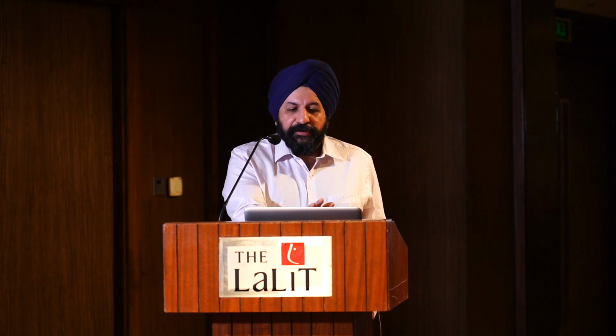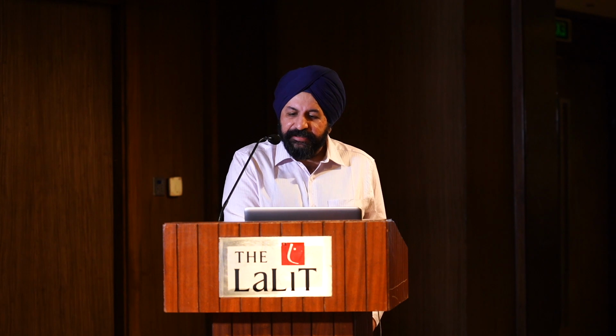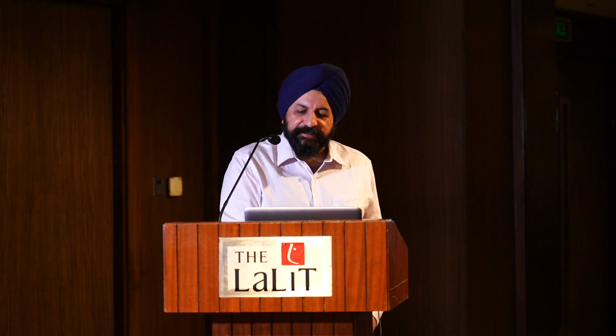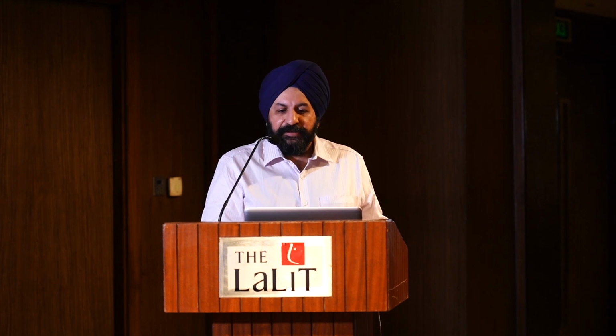So just another technology that I want to bring. Same way, when we do the neutrophil or any other cell line along the XYZ axis, we can differentiate all cell lines into X, Y and Z components. So again, like any other cell line, Neu-X depicts complexity, Neu-Y the DNA RNA content, and Neu-Z the cell size. Now why I am telling this is because Neu-Y is an important parameter which can help diagnose sepsis and differentiate bacteremia from septicemia, which I will discuss later.